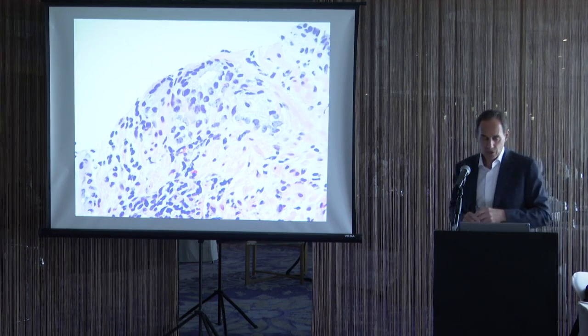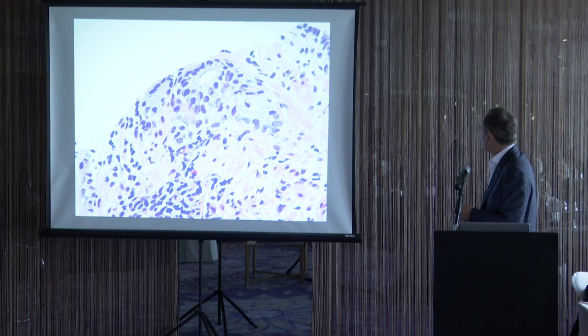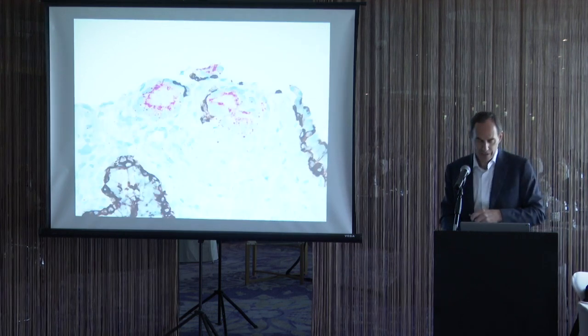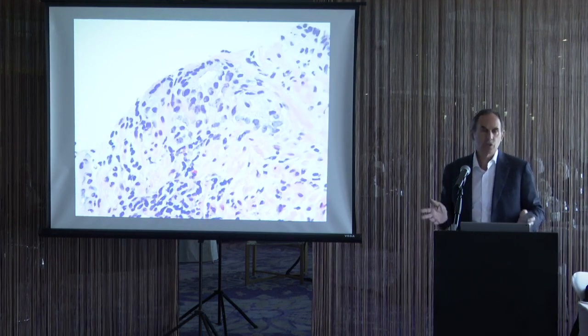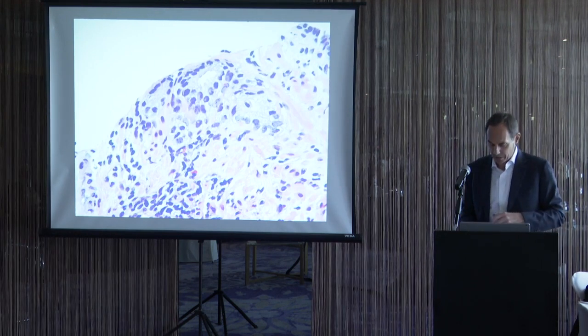Again, we're on the edge of the core here. You would think, oh, this should be cancer. There's some good nucleoli. But again, on the edge of the core, you have to be careful. The outside contributor had done a basal cell marker, and these are patchy for basal cells. So it shows you why, in this case, you shouldn't be calling it cancer. So again, be cautious with atypical glands on the edge of the core.